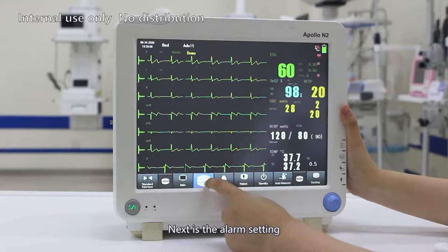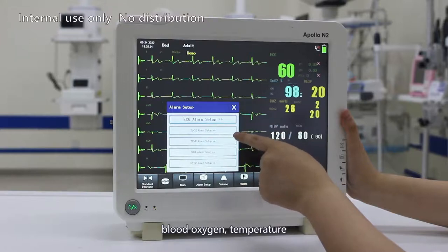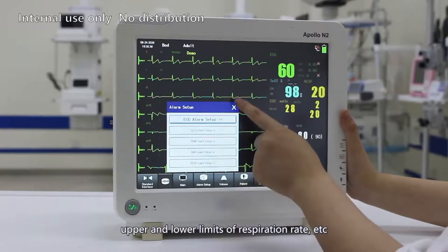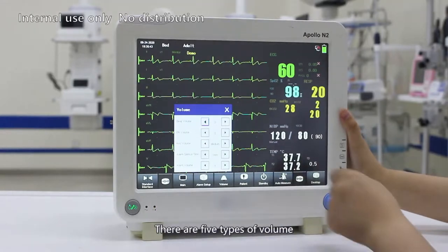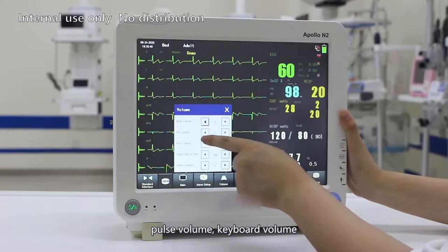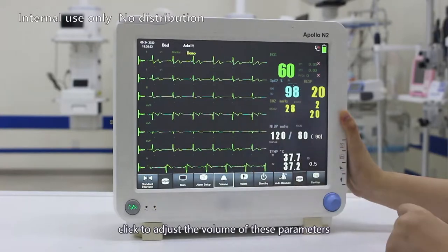Next is the alarm setting, which can set parameters such as ECG, blood oxygen, temperature, non-invasive blood pressure, and the upper and lower limits of the respiration rate, etc. Next is the sound setting. There are 5 types of volume, which are heartbeat volume, pulse volume, keyboard volume, alarm mute time, and alarm volume. Click to adjust the volume of these parameters.